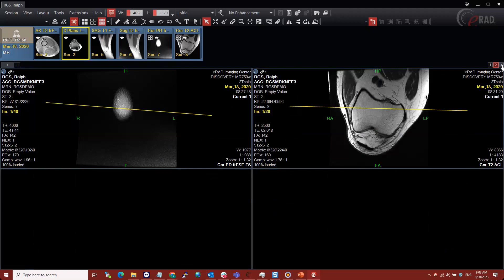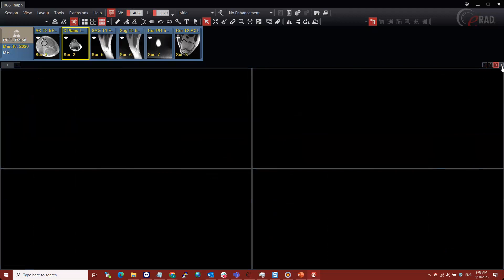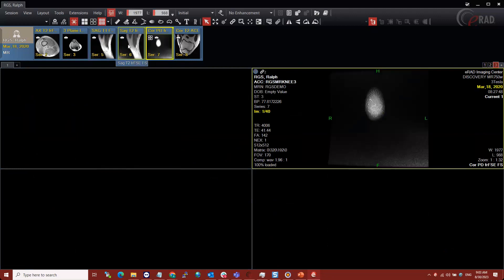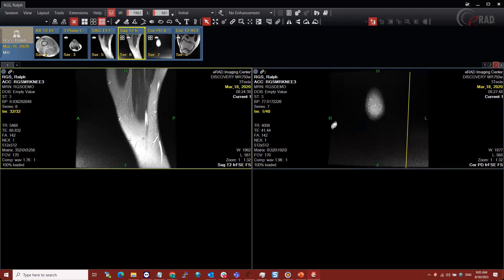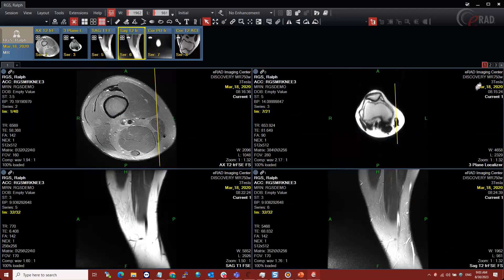I can add another virtual monitor manually by hitting the plus sign here, and then add different content on it. That allows you to build a hanging protocol that encompasses multiple monitors. Typically you won't use that feature a lot, but that's what it does.